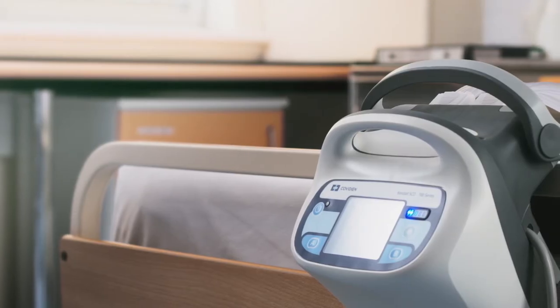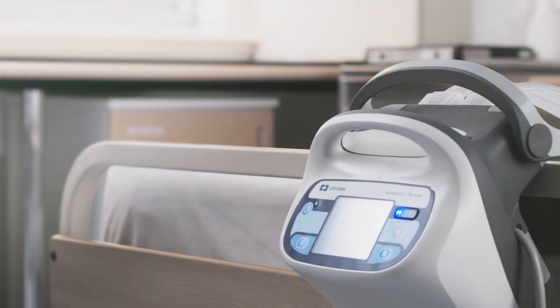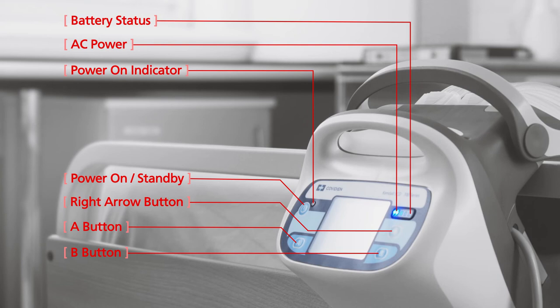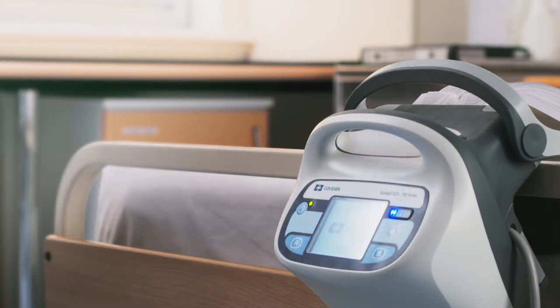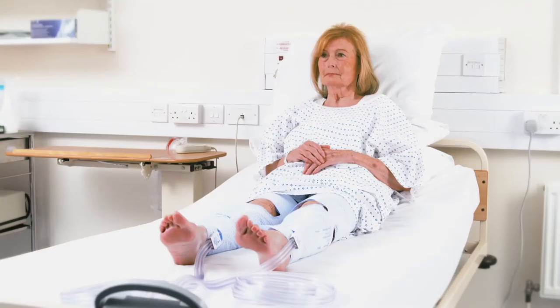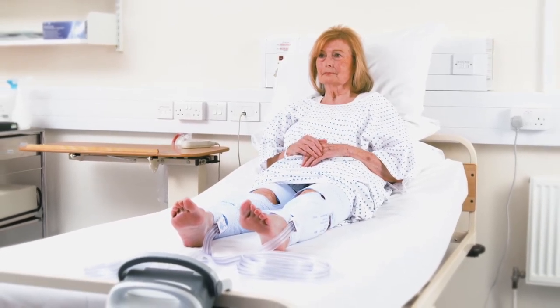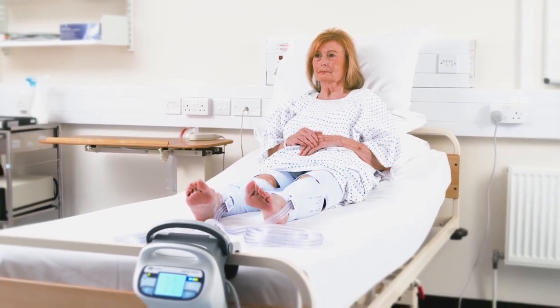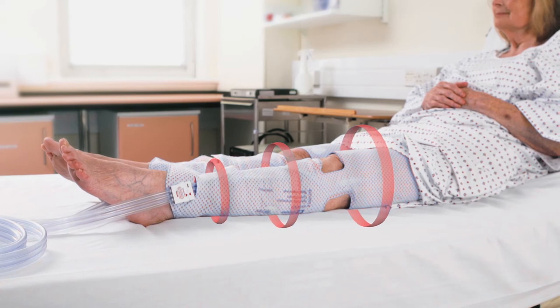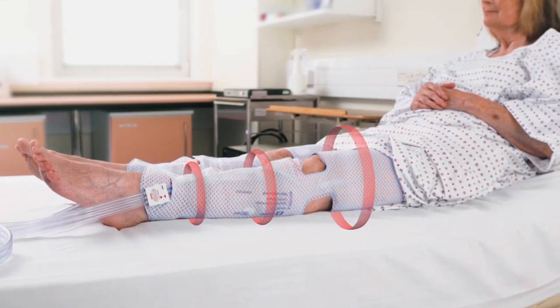The Kendall SCD 700 series controller has a simple, easy-to-understand interface with four buttons and three indication spots. Press the power on/standby button to begin operation. If using leg sleeves, no further intervention is required, as the controller will automatically detect whether a knee length or thigh length sleeve is being used and begin to deliver the set pressure pattern of 45-40-30 mmHg.